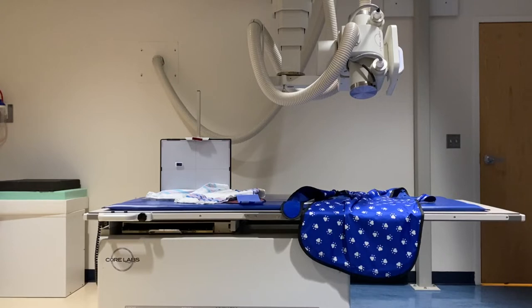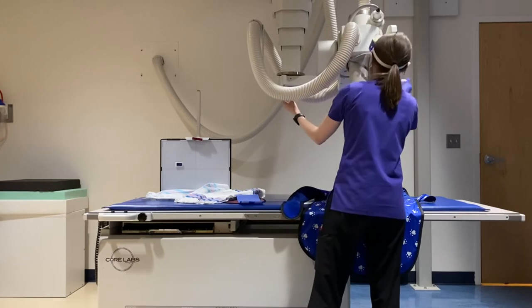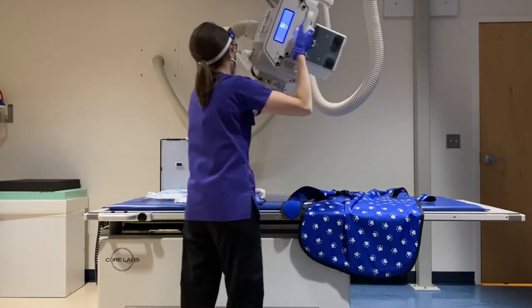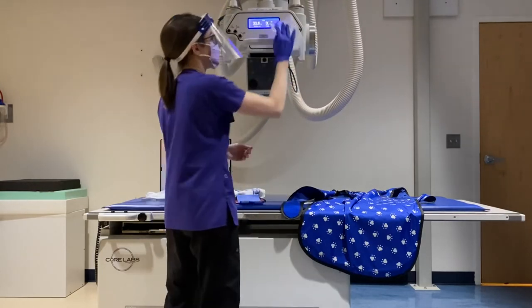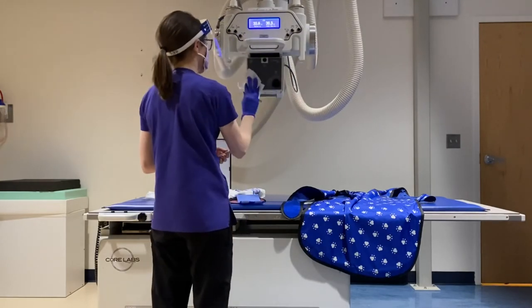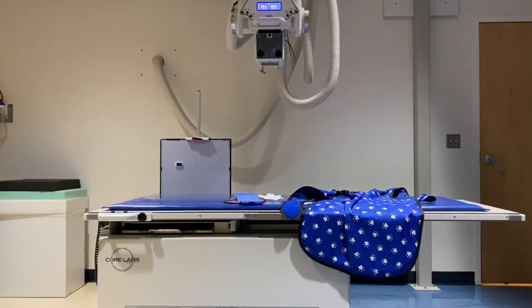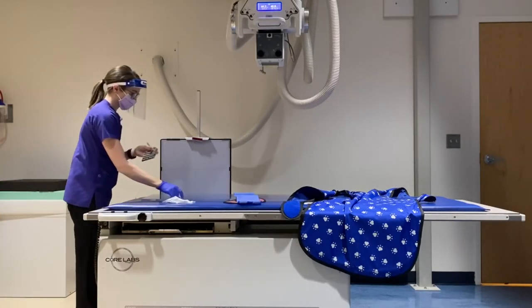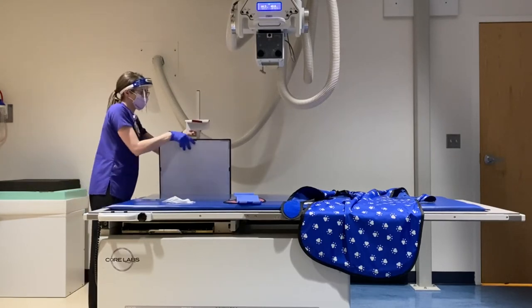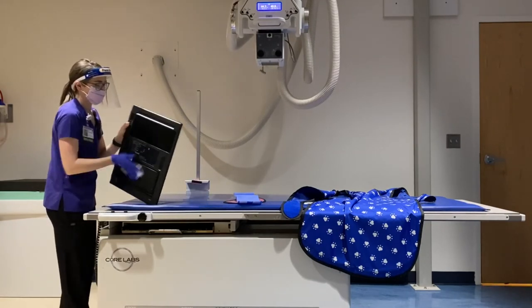This is what the typical aftermath of a baby chest x-ray ends up looking like. Some people choose to roll the baby onto their side to do the lateral chest, but I typically like to do a cross-table horizontal beam lateral. It's more comfortable for the patient, and parents can understand and follow directions better as to how I need the patient to be positioned — so it's easier for everyone except for the tech, but I don't mind at all. It gets good pictures. I'm just taking the large image receptor out of its stand and placing it back into the table bucky.